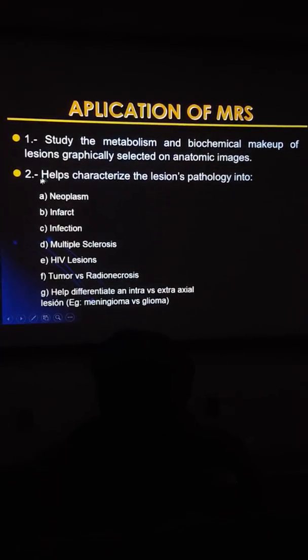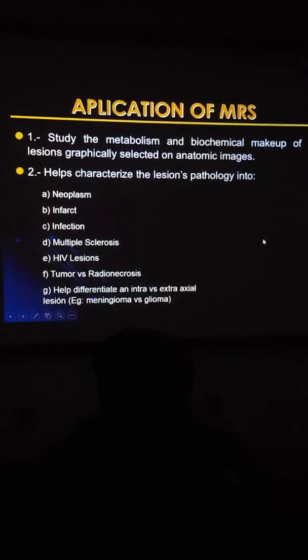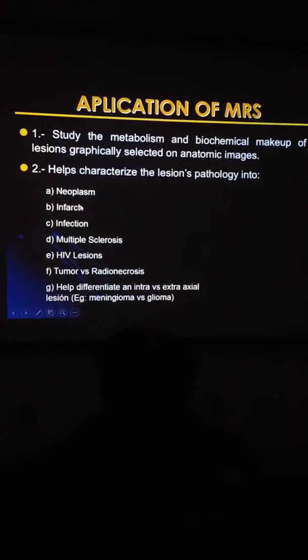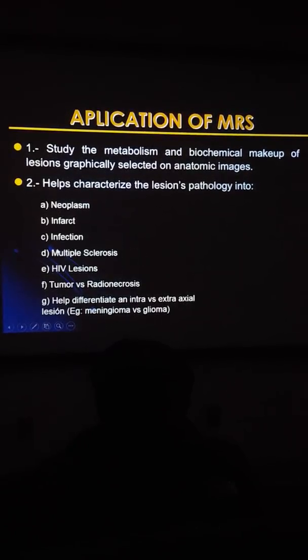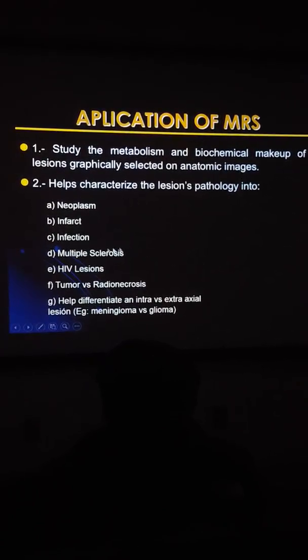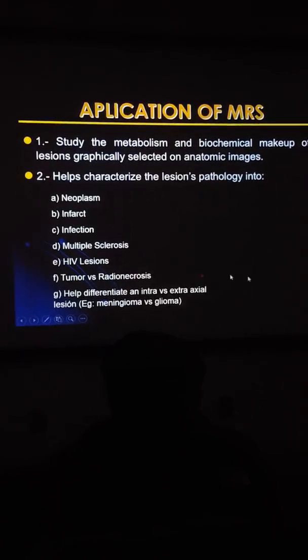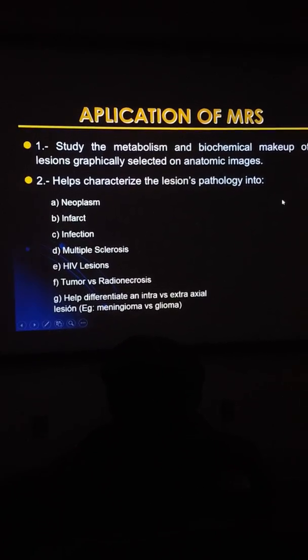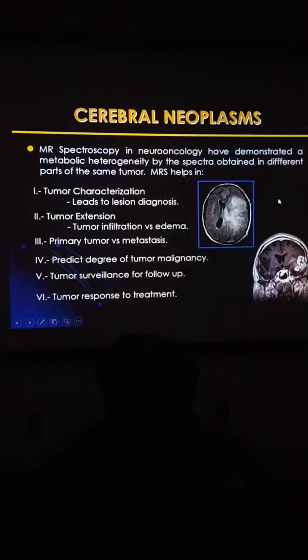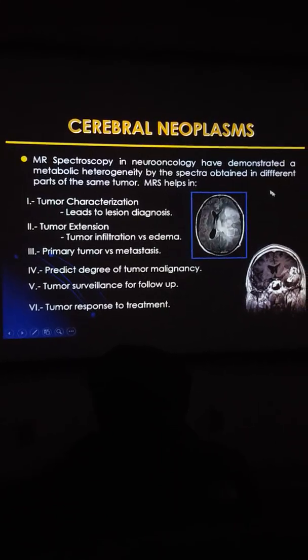So evaluation of tumors is very important. It's a very important application of MR spectroscopy. Evaluation of infarcts, evaluation of infection, multiple sclerosis, patients that have different expressions of HIV. So all of these types of pathology, the extra dimension of metabolic information helps in the differential diagnosis.